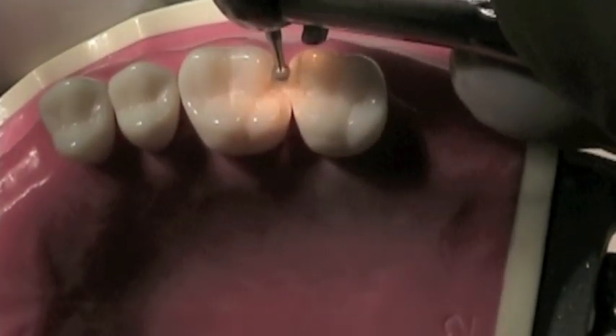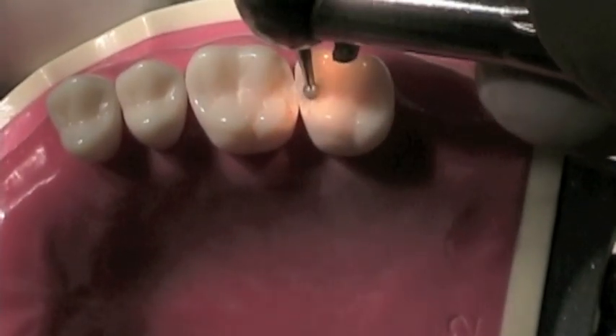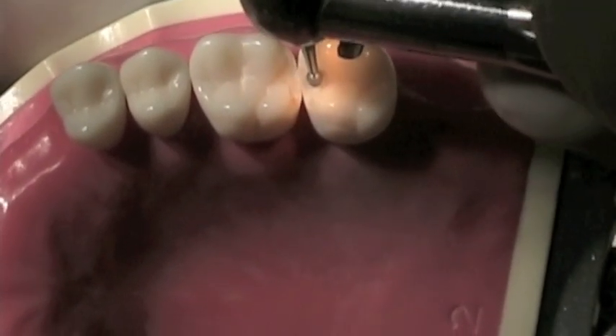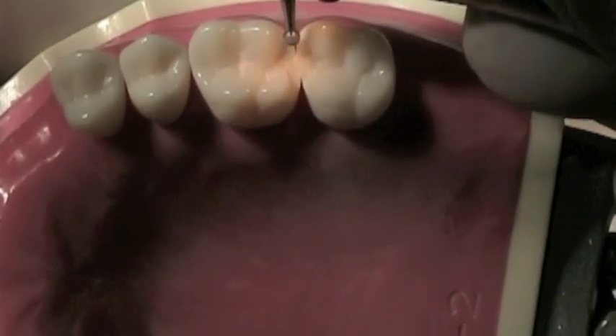Lastly, form the triangular occlusal portion of the rest seats, making the central portions the deepest. The rest seats will look as though the marginal ridge areas are very broad. This is necessary to provide sufficient bulk for the strength of the direct retainer.